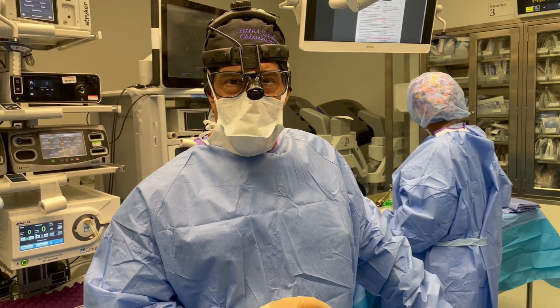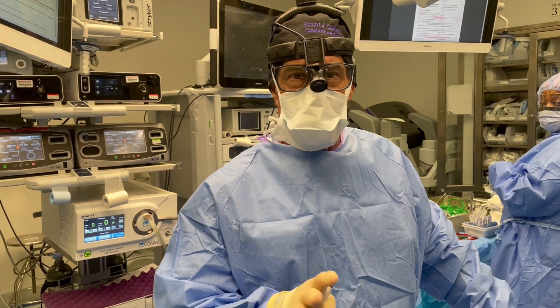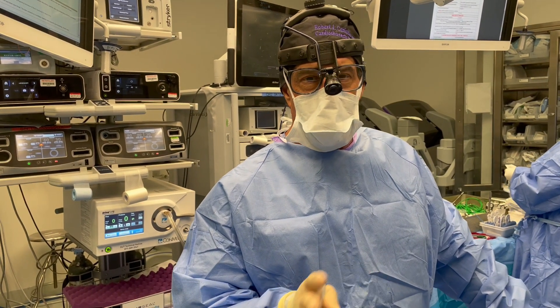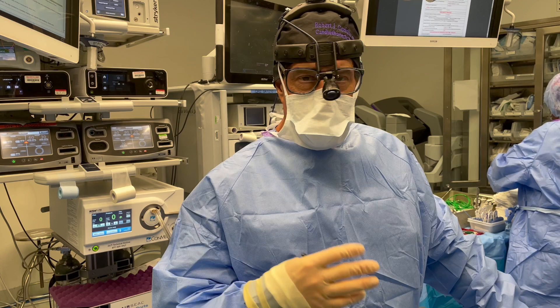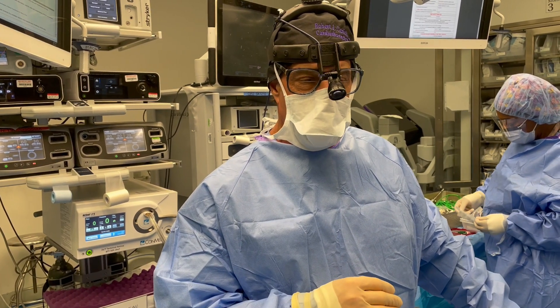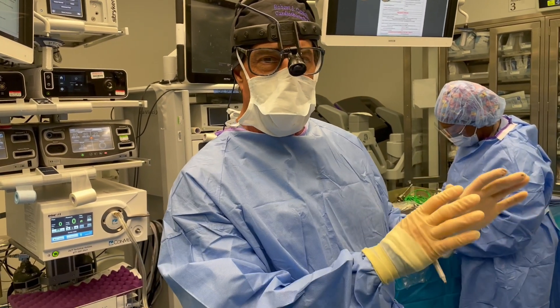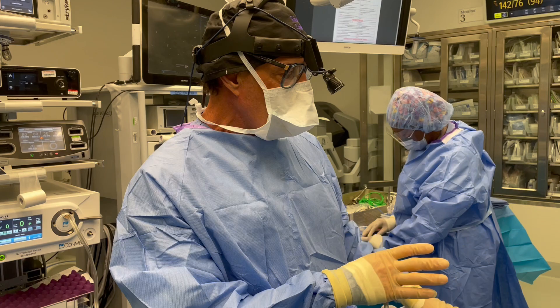We're going to do a left robotic thymectomy. I used to favor going sub-xiphoid, and now I haven't been so happy with the sub-xiphoid, either with the SP or even the XI. Most of you won't have the SP — you're going to be using an XI. You can go sub-xiphoid, but a lot of people still like the chest. So now we're going to show you how we do the incisions for the chest.